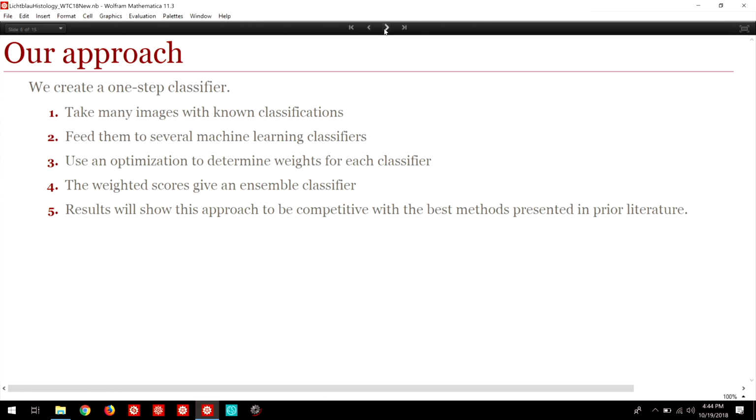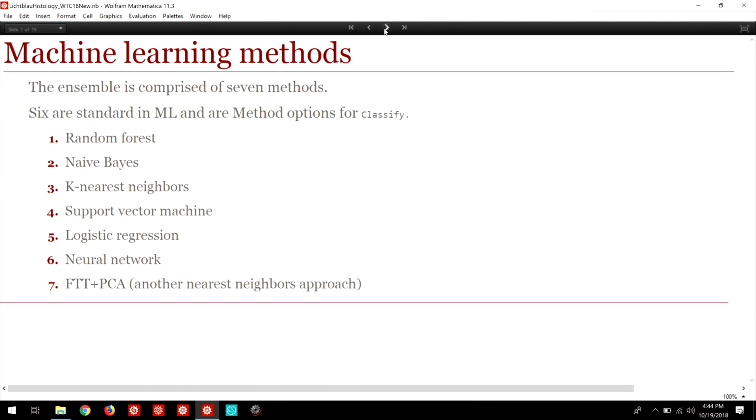We did not know back then exactly what the Classify function did or how. Actually, only yesterday we found out at this conference that, to share the secret with everyone, it has a convolutional neural network behind it. It produces 1,024 features. The features produced by the AlexNet convolutional neural network are extracted and fed to the classifier next, so the classifier can be applied on these numerical values.